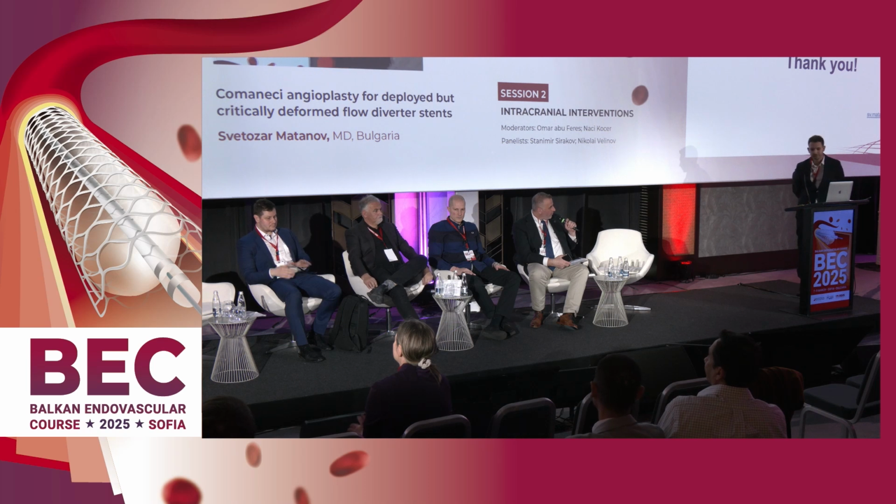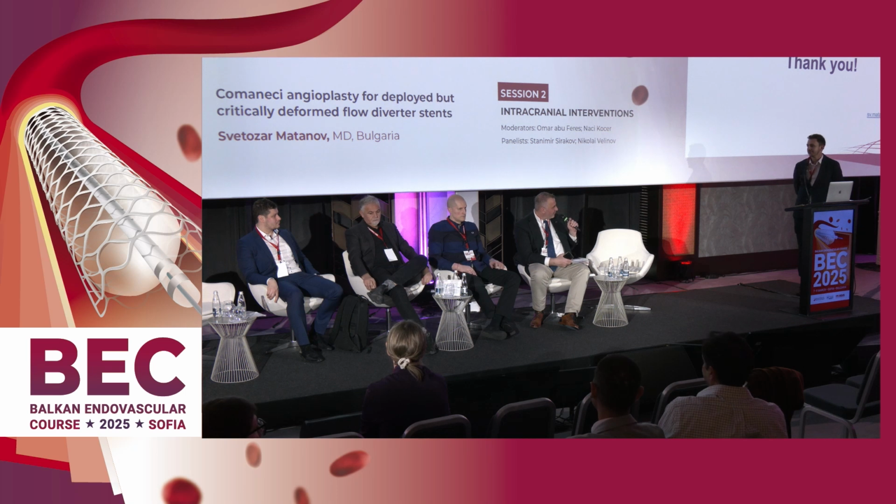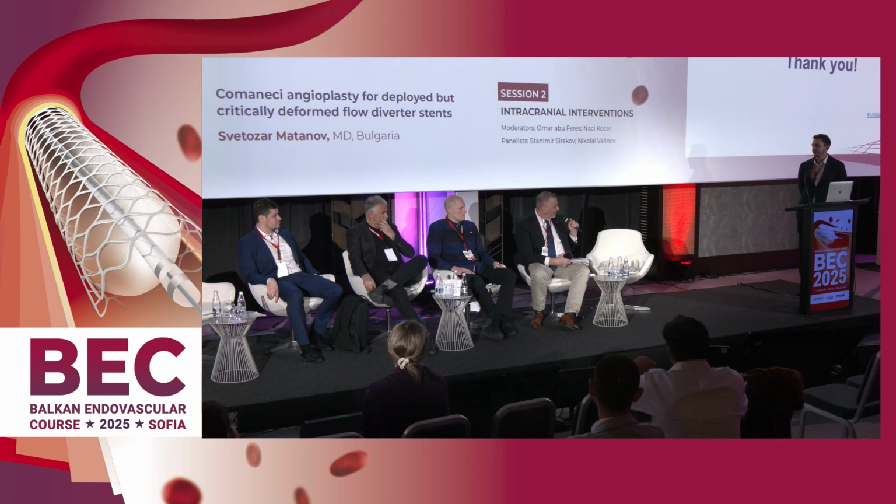Thank you for your wonderful presentation. It is absolutely, as you said, in many scenarios, you think that the stent will land in some place, but you end up in a totally other place, fish mouthing. So you need to have possibilities to open, sometimes in instances of stenosis. There are different options, but obviously Comaneci works very well. I know the experience of Professor Sirakov with Comaneci, it's great.